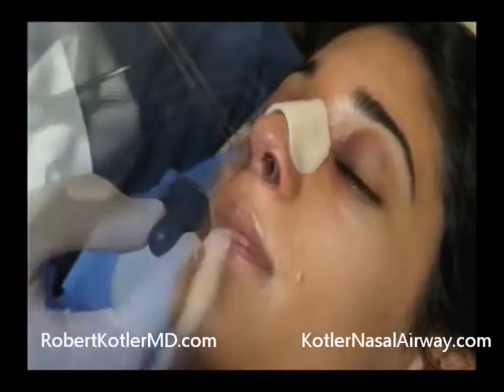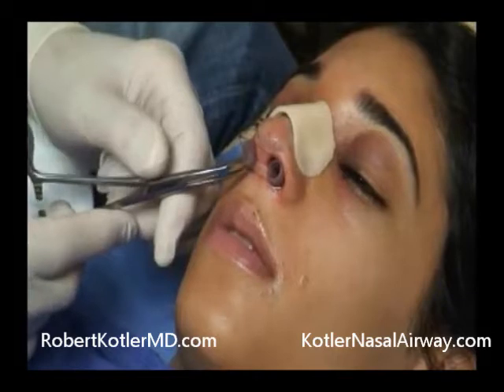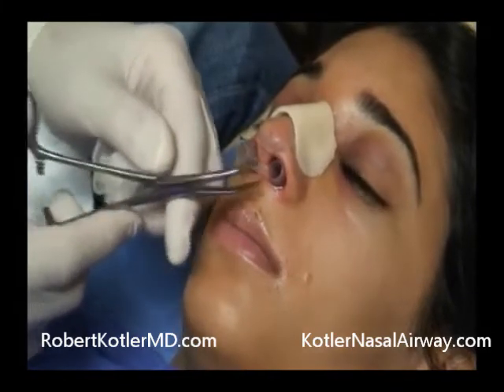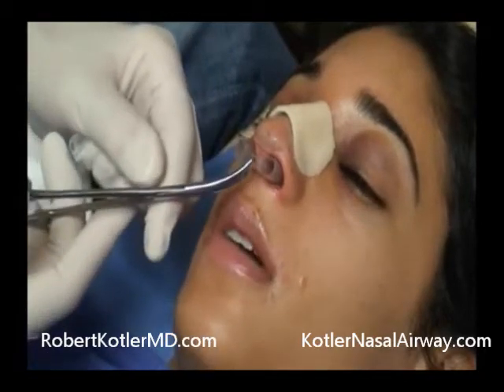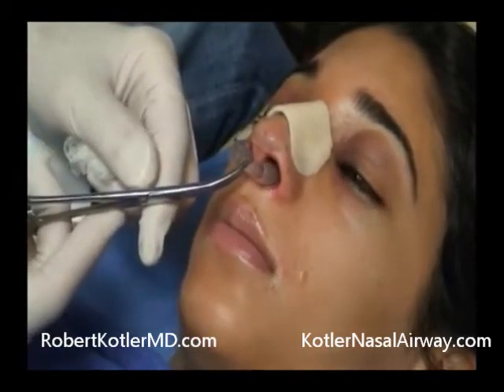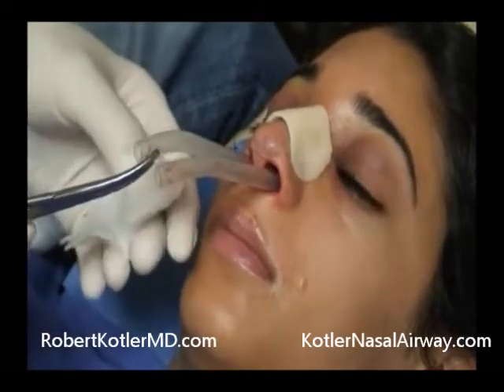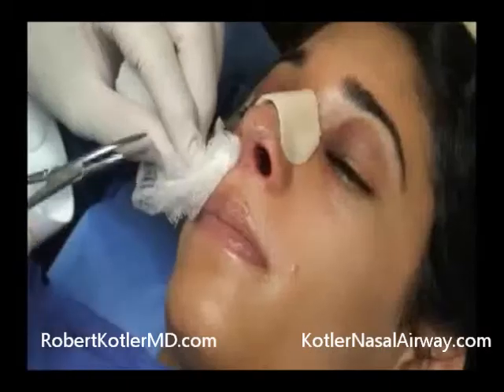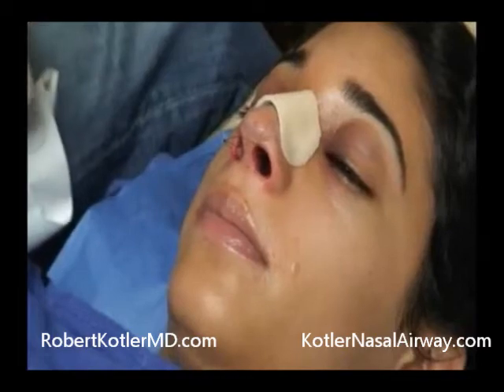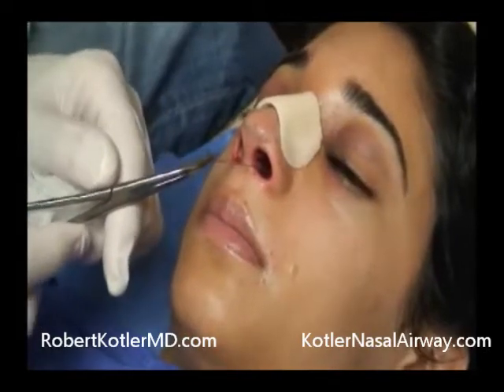Very good. What I'm going to do is just very gently, with a standard Kelly clamp, just a little bit of forward motion of the airway tube on both sides. And once you do that, then you can very handily put the clamp underneath the bridge. 1, 2, 3, coming out, done. Fantastic. Very nice. Great. So now what we're going to do is just take out the little Telfa pads on the inside. And I'm just going to tug a little bit on the stitch. Good.